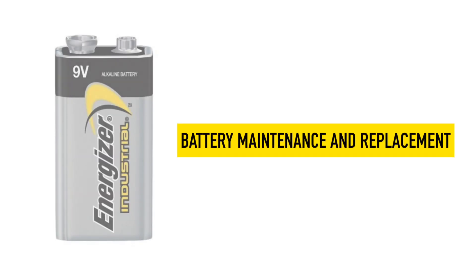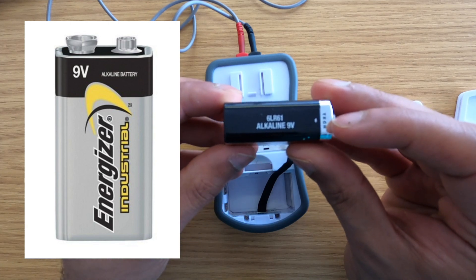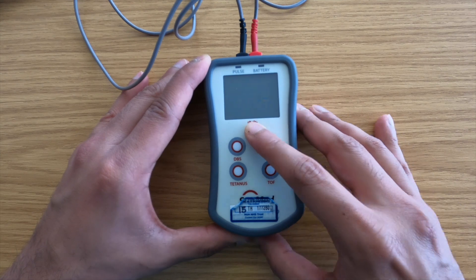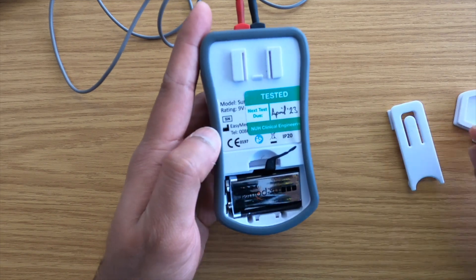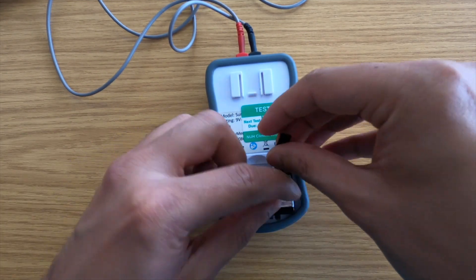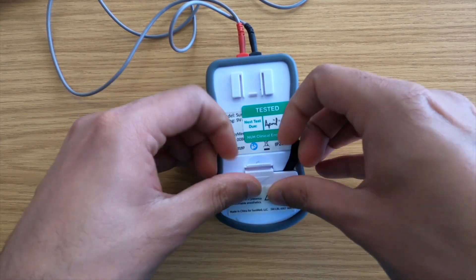Battery maintenance and replacement. This device shall be used with a 9V alkaline battery only. Prior to battery replacement, make sure the device is turned off. Slide off the battery compartment cover. Remove the old battery and install the new battery ensuring correct polarity. Place the battery cover back into the original position.